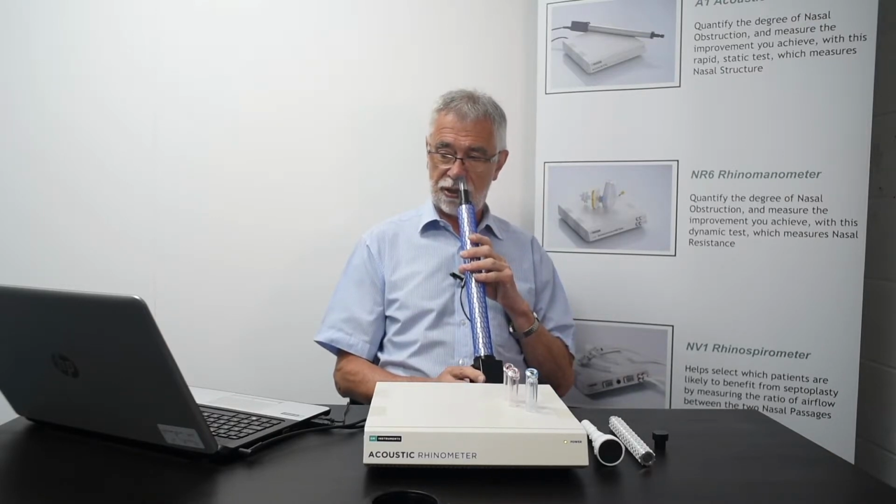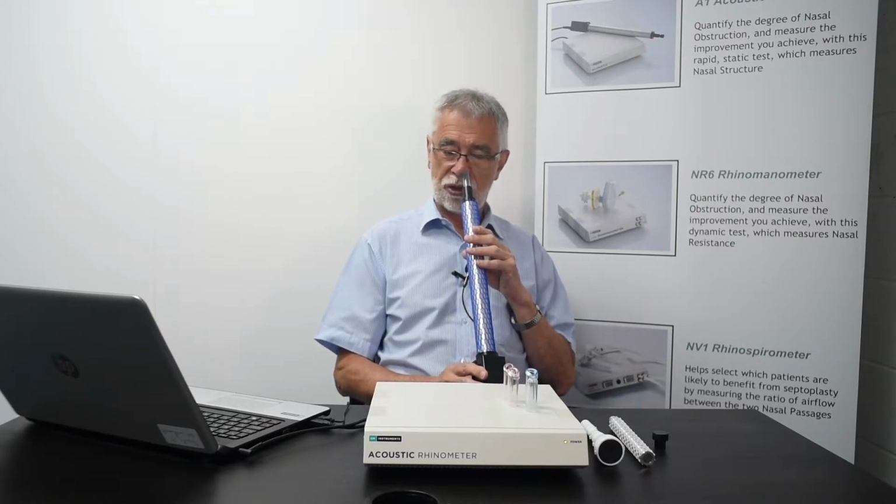But once you've got it in the right position and the subject is supporting the sound tube appropriately, the instruction to them would be to continue to mouth breathe while this process is going on, and when you're ready to make a measurement, ask them to take a breath in and hold their breath. So take a breath in through the mouth, hold their breath, and then the measurement can be taken. So I'm now ready to make a measurement. Take a deep breath in, please.